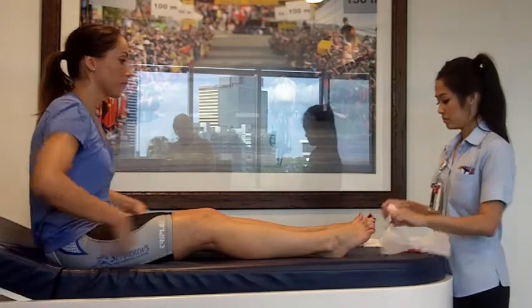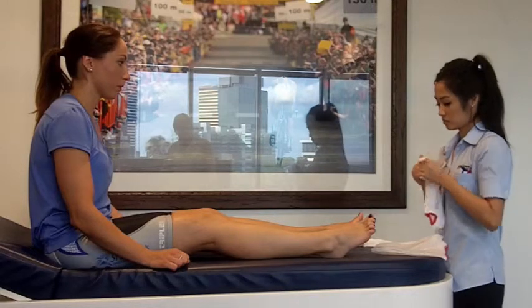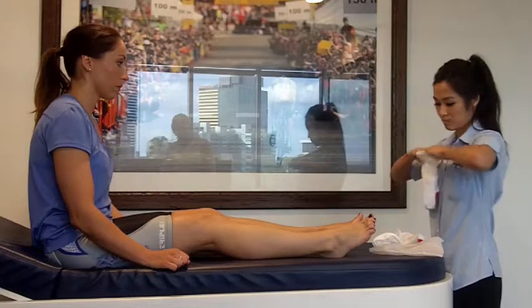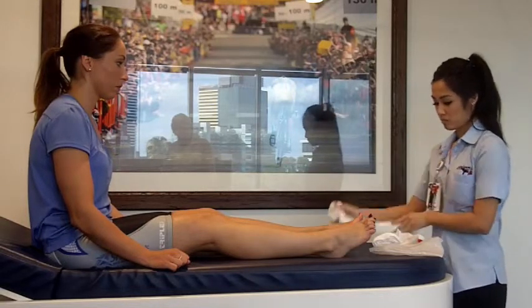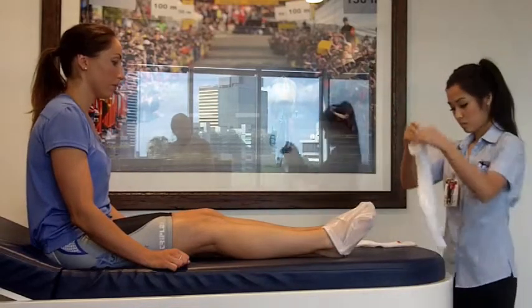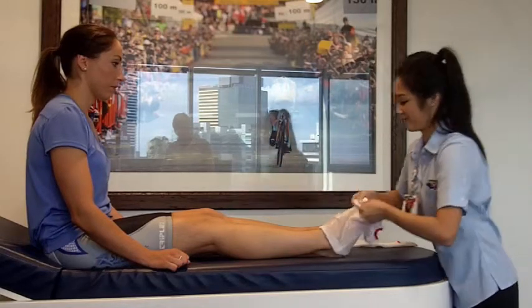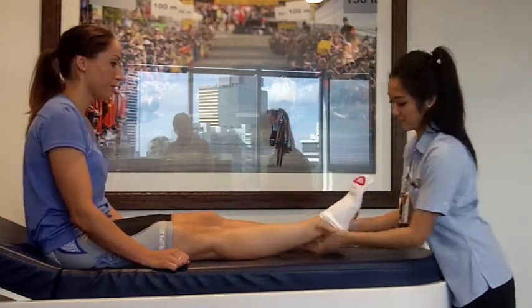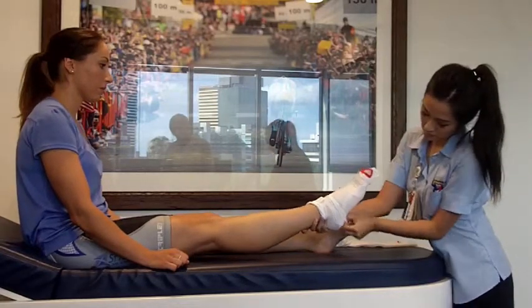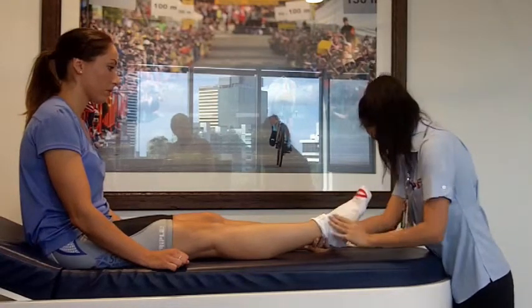First of all, you would just stretch the stockings — that does help somewhat — and you'll probably have one or two pairs to go home with. You just pop the bag over the foot you're going to apply them to and then stretch. You do need to be a bit strong and hold your breath, it seems to help. Underneath the stocking you'll feel there's a raised area, and that's to help stop you slipping.